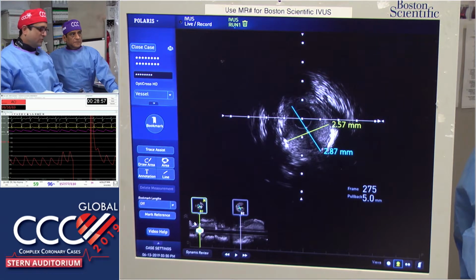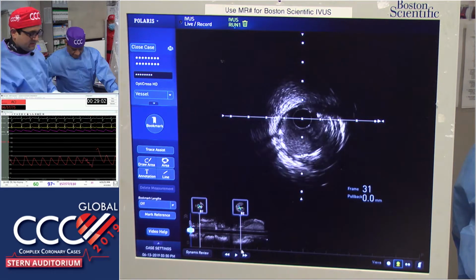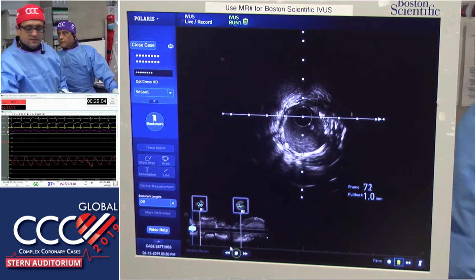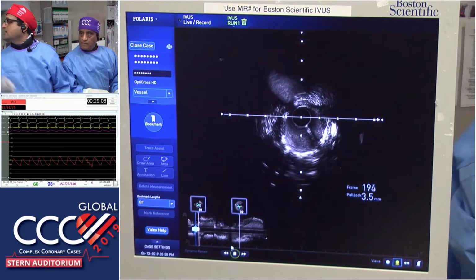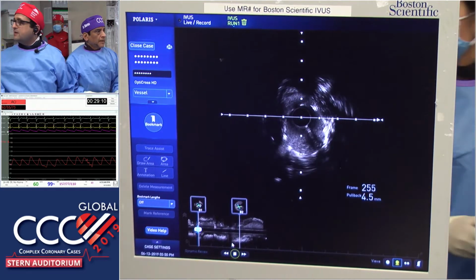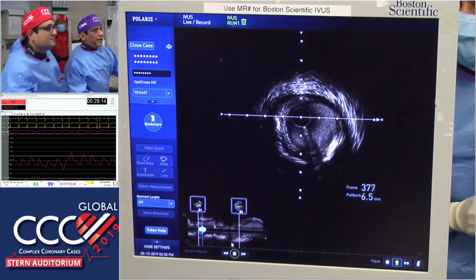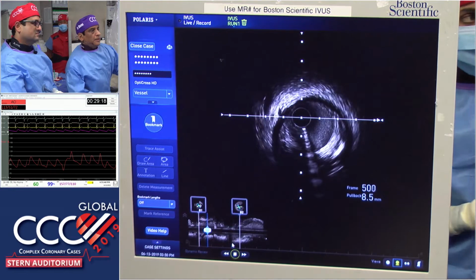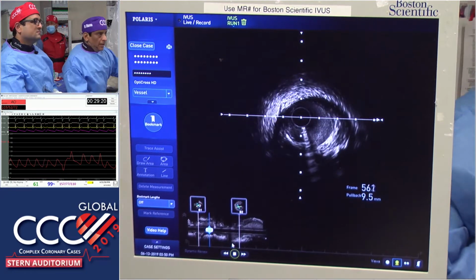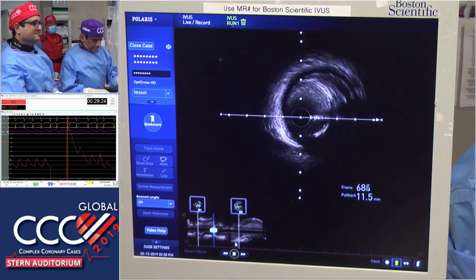But this part is not the stenosis. I mean, just to be fair, though, you have chronicity on angiograms. It may be obstructive, and you're stenting it because it's obstructive, but not because. Okay, now you see here, they will be ready in room 2, with the total occlusion. I always leave the wire in the side branch to decrease the chance of obstruction. And here, all right, that ulcer is bye-bye. Bye-bye.